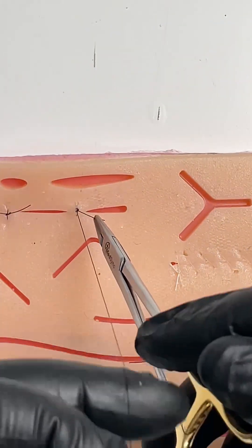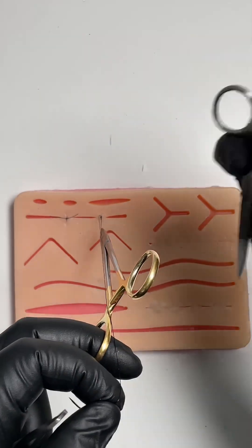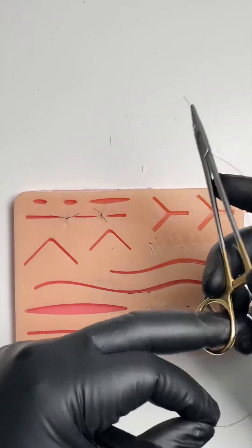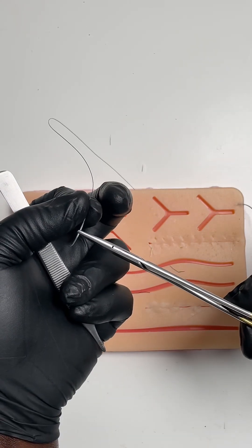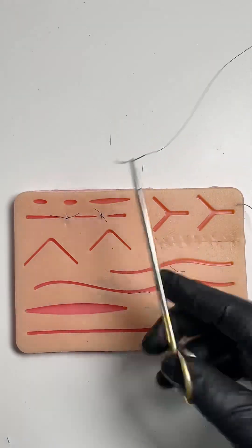Put everything into one hand, get your scissors out like so and cut — and like magic the needle is already in my finger, ready to be mounted exactly where I want it the first time. My forceps are already in my hand and I can continue.